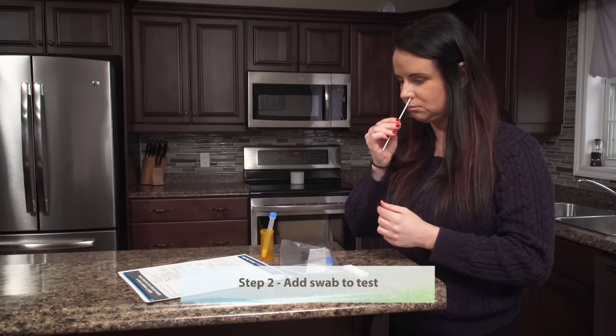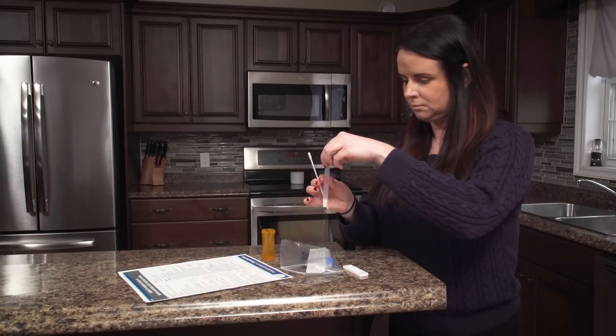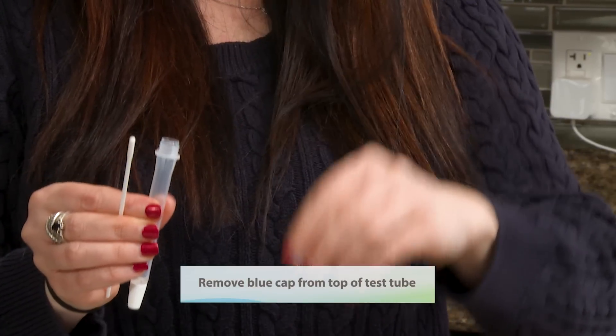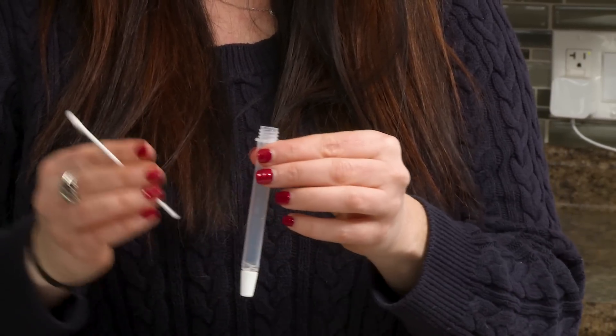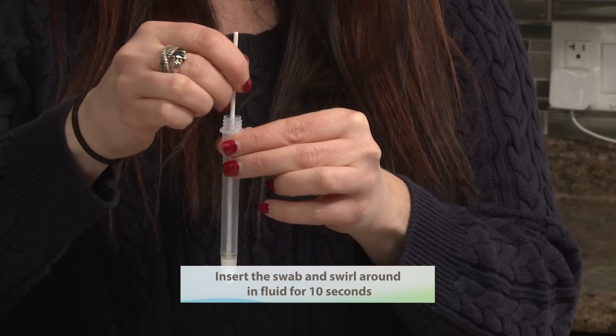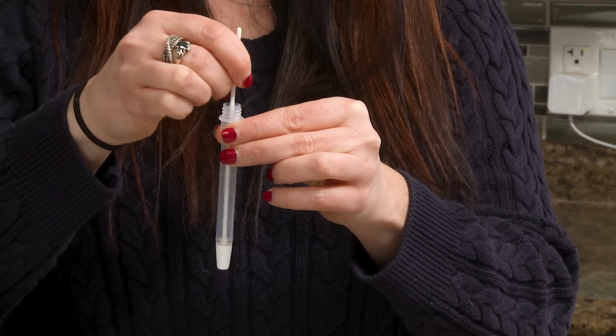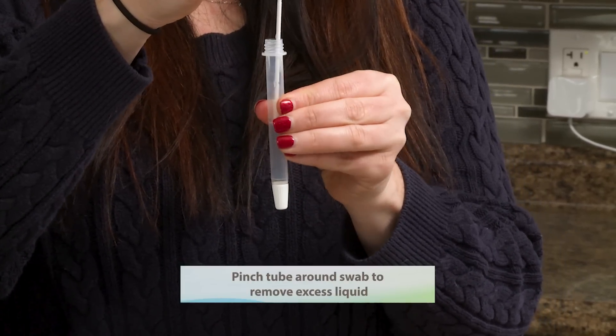Step two: add swab to test tube. Remove blue cap from top of test tube. Insert the swab and swirl around in fluid for 10 seconds. Pinch tube around swab to remove excess fluid.